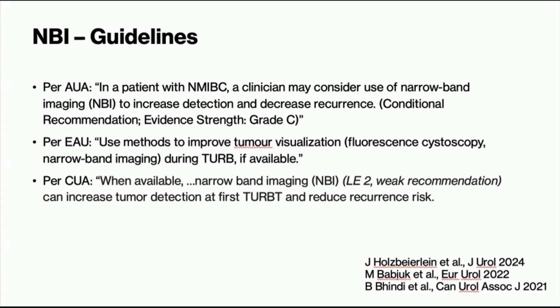But certainly, it's an area that's worth further consideration and further study in terms of how it can be integrated into your potential daily workflow. But shifting gears a little bit, blue light cysto and NBI, these are things that are actually integrated into your guidelines, but there are technologies that are still evolving day to day.